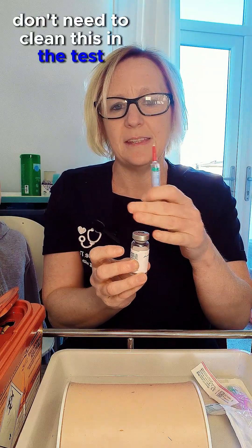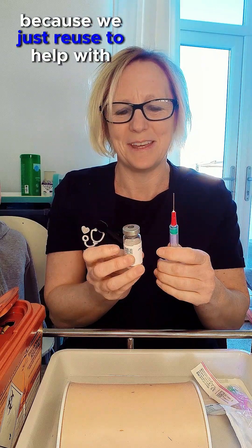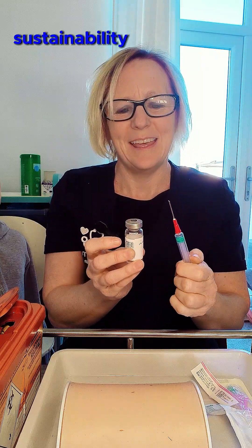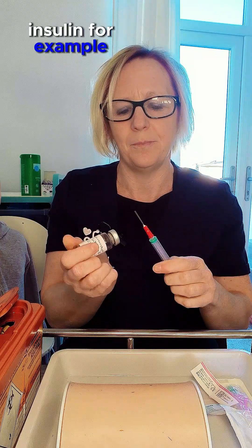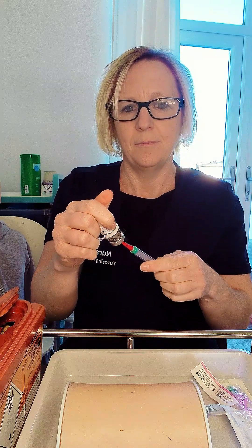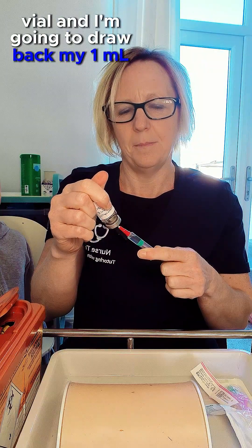In the test centre this will be a single-dose vial where you take the top off. We don't need to clean this — it's not a multi-dose vial like insulin, for example. I'm going to invert my vial and draw back one mil, then expel any air.